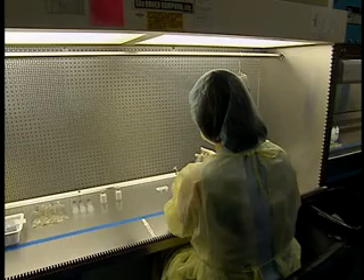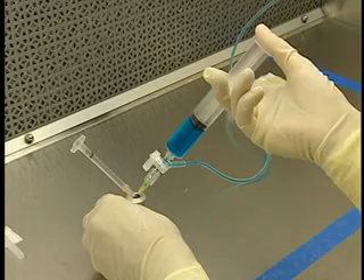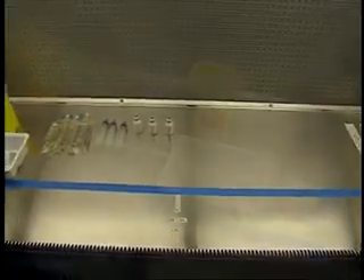During manipulations, care must be taken not to obstruct or disturb the laminar airflow. The work should be performed in the center of the hood and objects arranged along the sides.